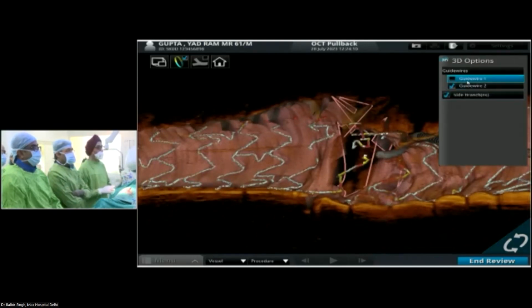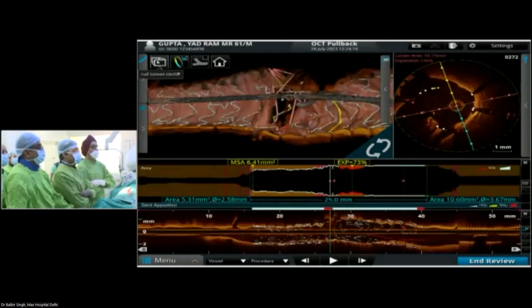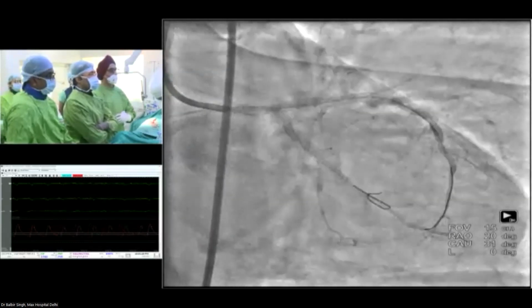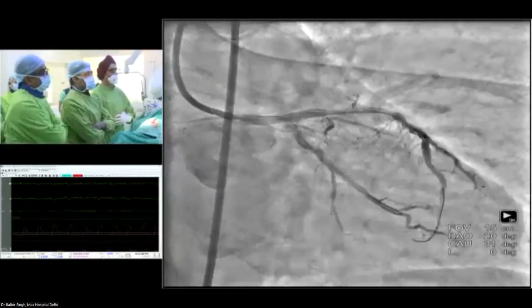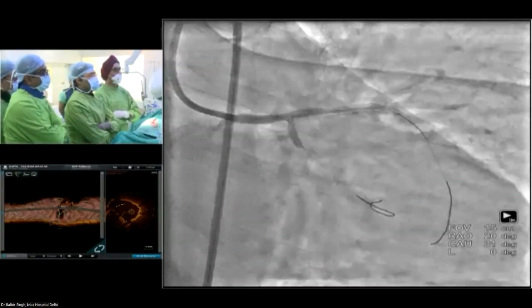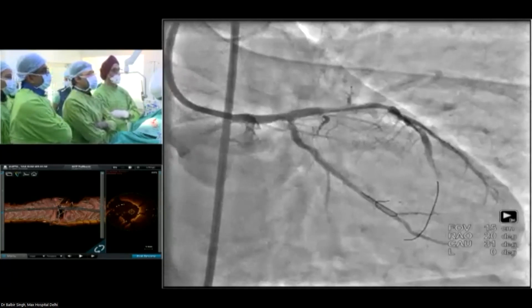So yeah, we understand you had hemodynamic problems with this patient. That's why you immediately performed stenting from the left main to LAD, right? Yes, right, exactly. So now we show the stent. Next picture. I think this is very important for younger doctors, not to lose time to wire or to predilate circ if there was a huge problem in left main. So please fix first the main vessel. And then, of course, we will have now even more difficulties to cross circ, but don't forget, nowadays we have excellent wires with angulated microcatheters. So I am quite 100% sure we will be able to recross the LCX to perform at least kissing, maybe T-stenting.